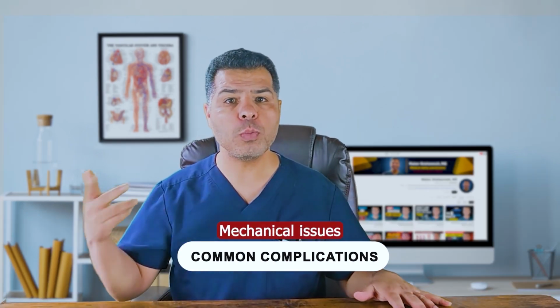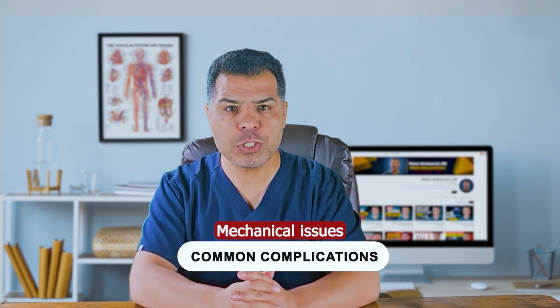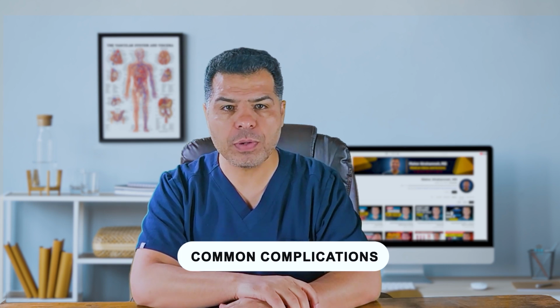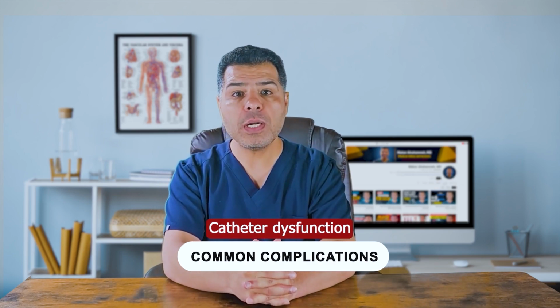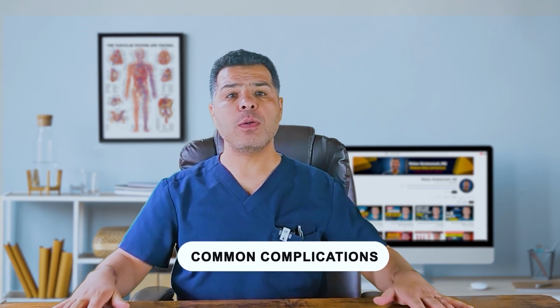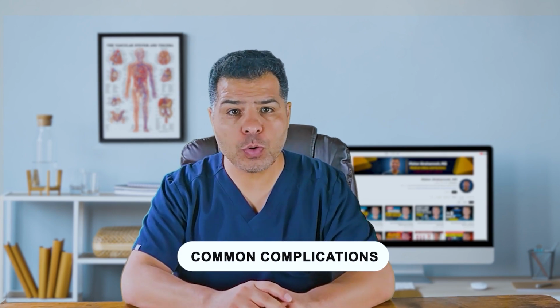Mechanical issues include pneumothorax, arterial puncture, air embolism, and catheter malposition. So always confirm placement and use ultrasound guidance whenever possible. Catheter dysfunction can present as sluggish flow or inability to draw blood. Try repositioning or gentle flushing, never force it. For an occluded catheter, alteplase 2 mg with a 30 to 120 minute dwell can be used to restore function.